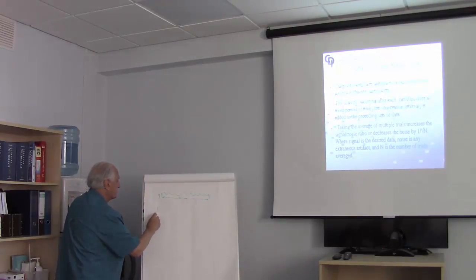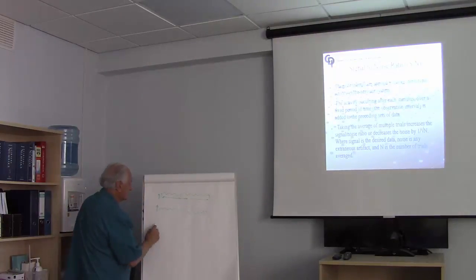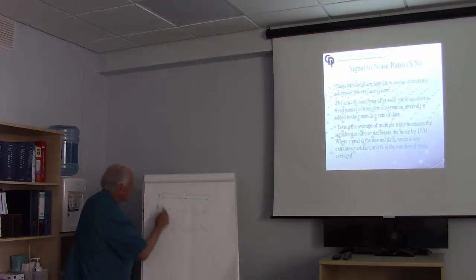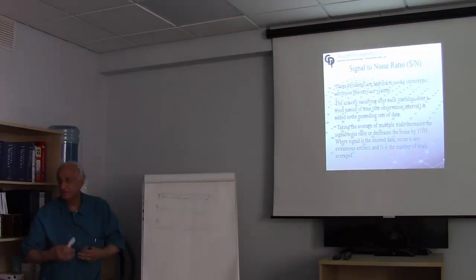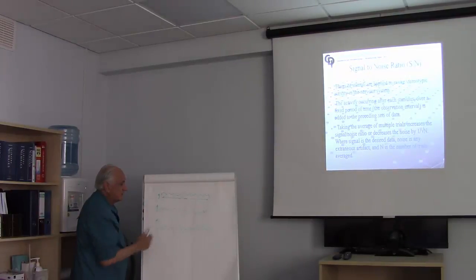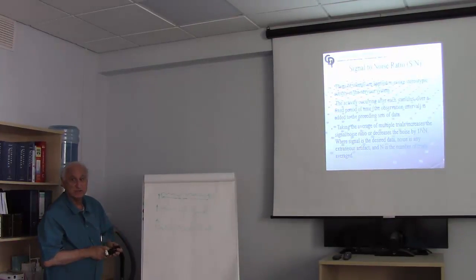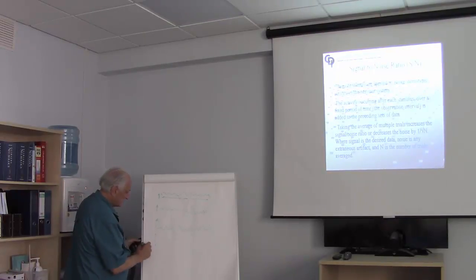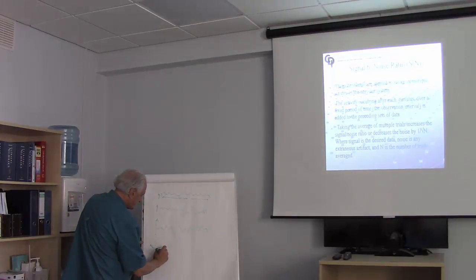Okay. You apply another stimulus, and you get something that looks the same, and you apply another stimulus, and you get another. In fact, what this evoked activity looks like from the scalp, it looks just like EEG, because the signal you're actually interested in is buried in this ongoing EEG. So to extract that signal, you make several assumptions. On the brainstem potentials, we want to extract this. We're going to do this 1,000 times. Say we want to extract an auditory brainstem potential, and it's going to look like this.